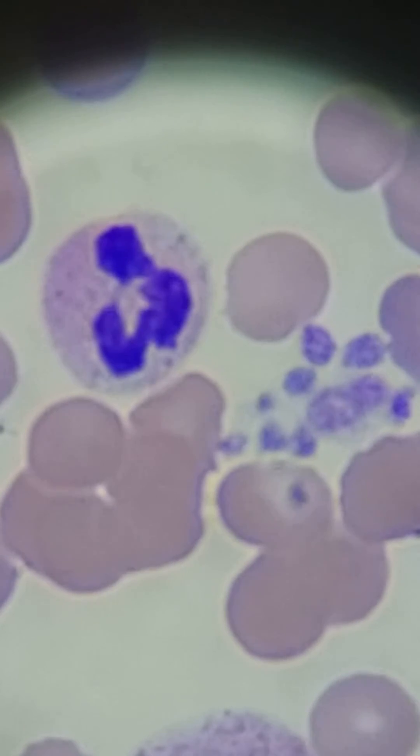The platelets are marked as low — there are 117,000. But as you can see, you have a platelet clump right there. So you might do a smear review to check to see if those platelets are really low.